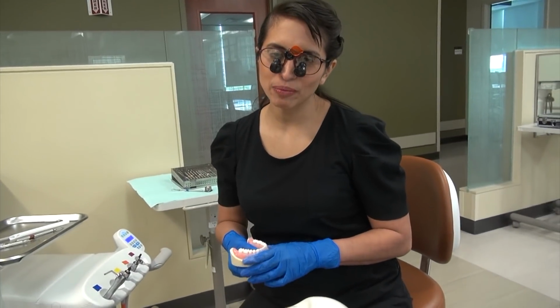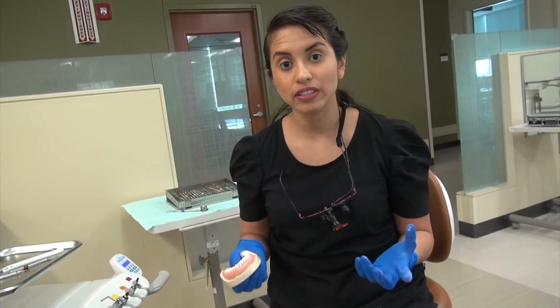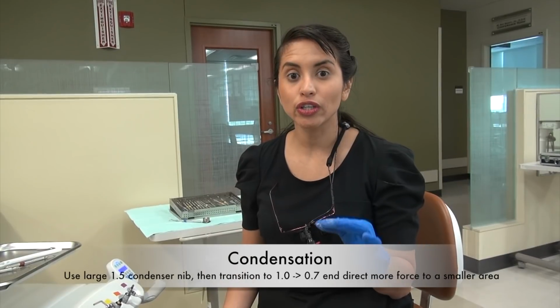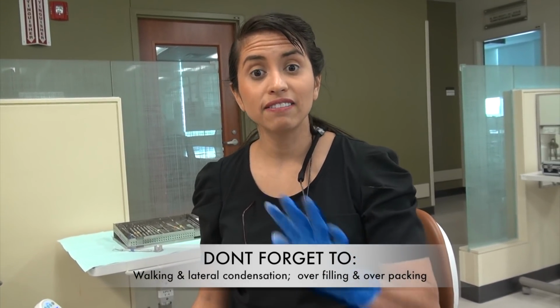Okay guys, well, good luck on your progress assessment. And keep in mind everything that we discussed. Make sure that you practice utilizing all of your instruments. Make sure that as you're condensing, you're going from the largest condenser and the largest end of that condenser, the 1.5 millimeter end, transitioning to the 1 millimeter end, then to the 0.7 and to the 0.5. So it will be your dark blue and your lighter blue. If you can do that and incorporate the walking movement, finishing with lateral condensations, creating those grooves, that's how you're going to make sure that you don't chip or create voids or submarginations.